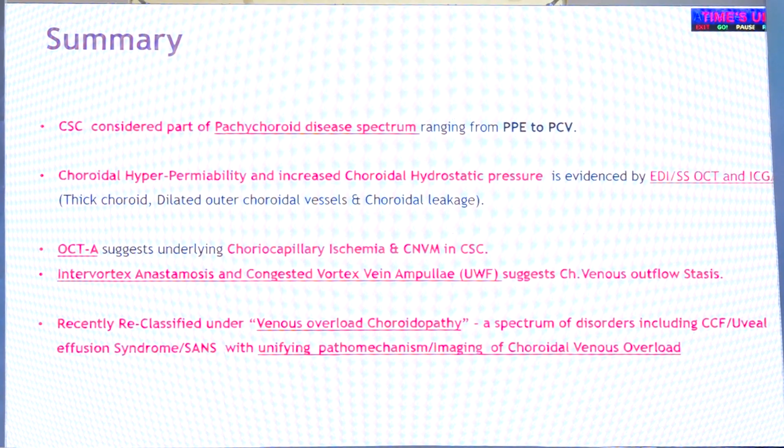To summarize, central serous chorioretinopathy is considered to be a choroidal disease, part of the pachychoroid disease spectrum, and choroidal vascular hyperpermeability as seen on ICG angiography and increased choroidal hydrostatic pressure as evidenced by Swept-source OCT by the presence of dilated outer choroidal veins.